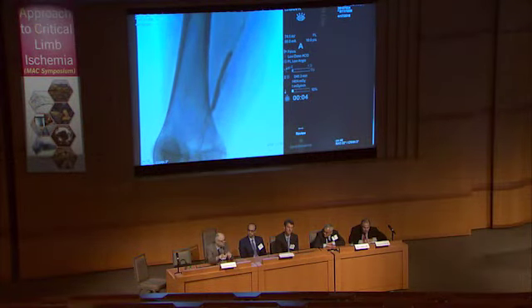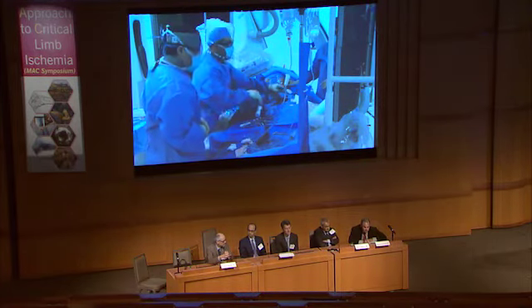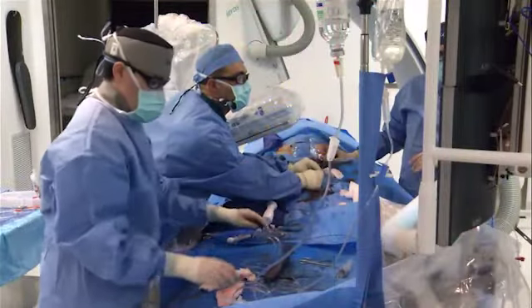What would be very helpful here is to have an ultrasound at least to measure the dimension and to calculate the dimension of the stent here. Any other panelists? What else would you guys do? Andre, what would be your IVUS approach?